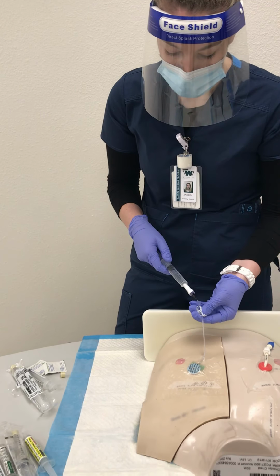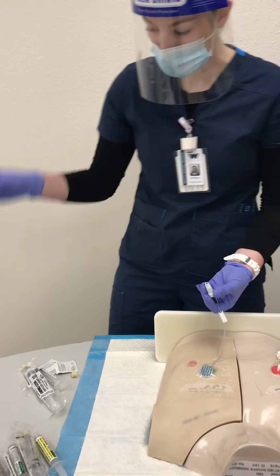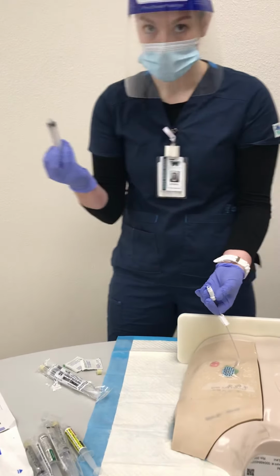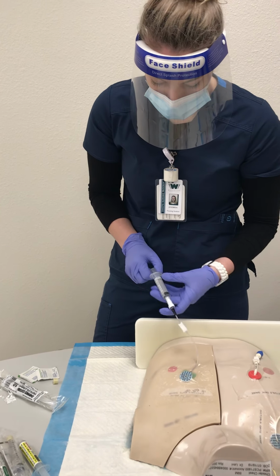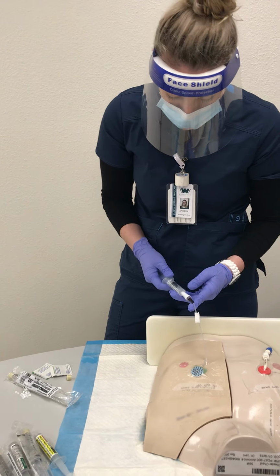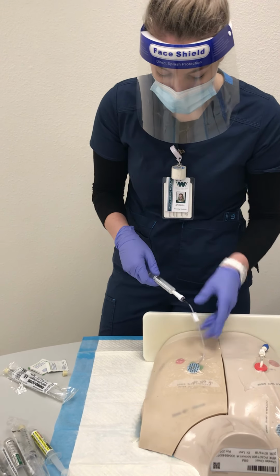And then I will lock. And I'm going to discard this sample. And then I'm going to need a new 10 milliliter syringe to attach. And then I can withdraw 10 milliliters. And then we'll lock again.